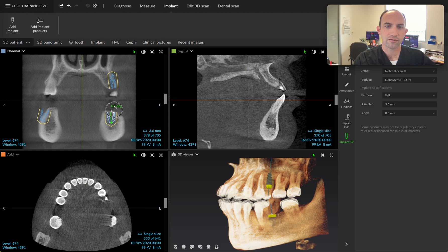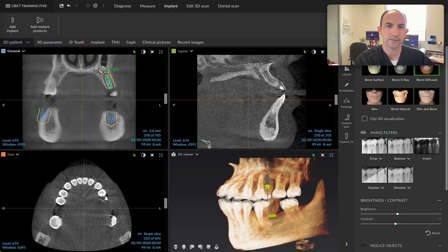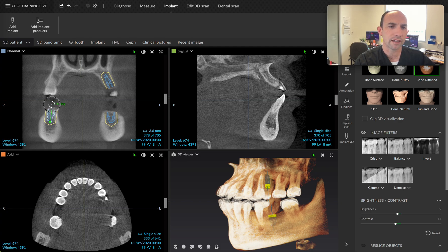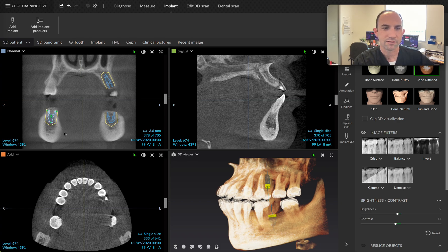I can also grab this implant over here and rotate it to make sure we capture that bone. You can see the little arrows — we can grab the arrows to adjust them, but it's just as easy to grab the body of the implant and move it around. For this one, the IA canal is not quite as clear. I'm assuming that it's right there, but you would want to do some investigation and of course delineate out that IA canal before you committed to placing an implant anywhere.